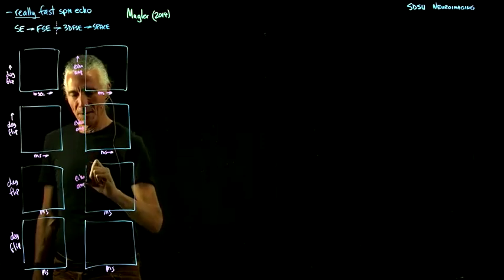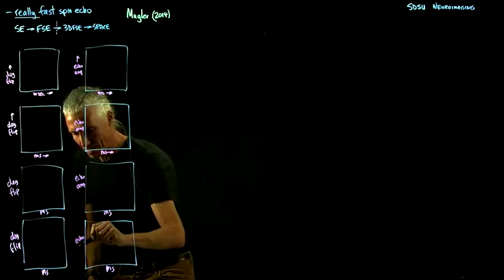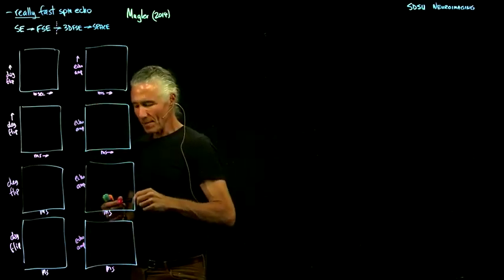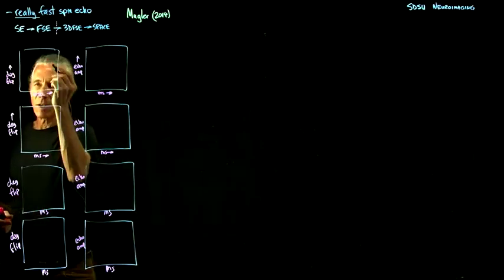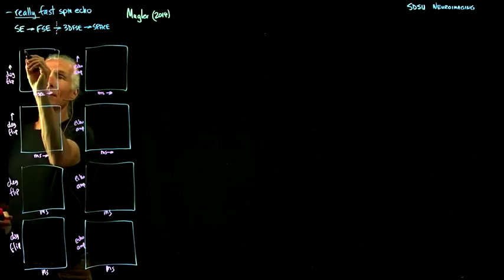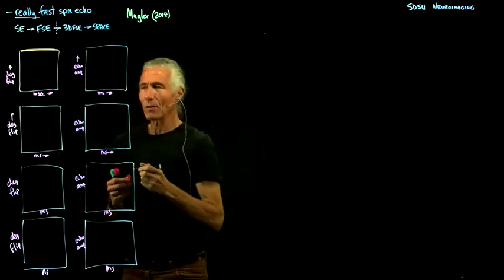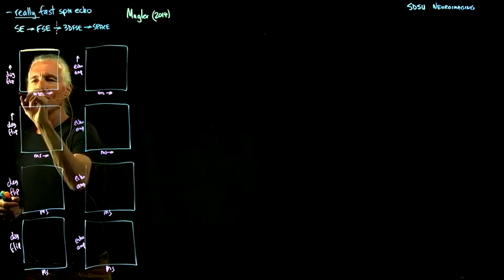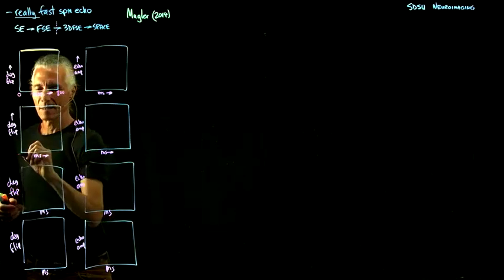So what is the actual strength of the echo? Also over time. So it's all over time. What is the first starting point, which would be like the 3D fast spin echo? Just do 180s. And then also, what is the axis here? So we're going up to a really long time, 800 milliseconds. So 0 to 800.